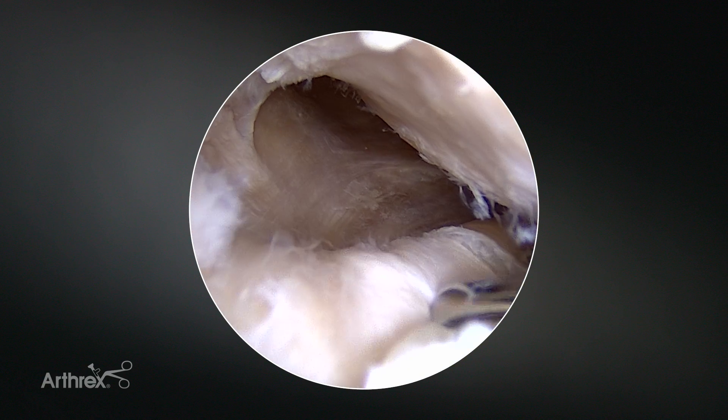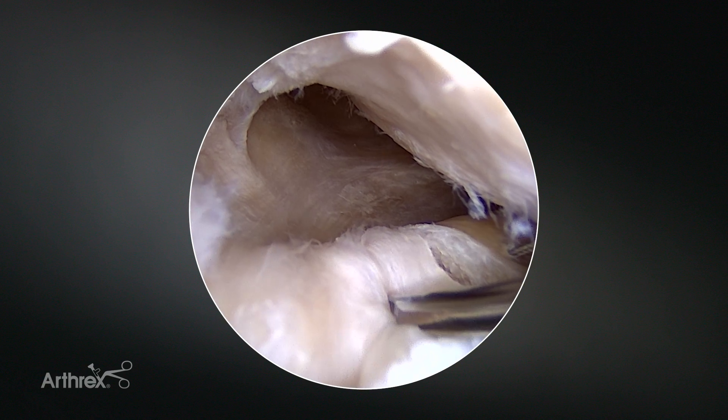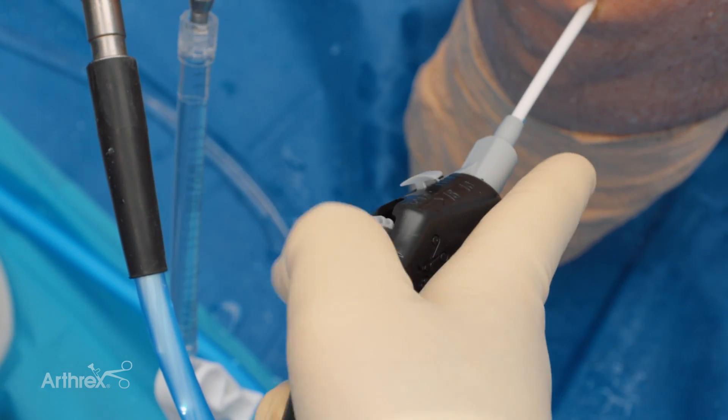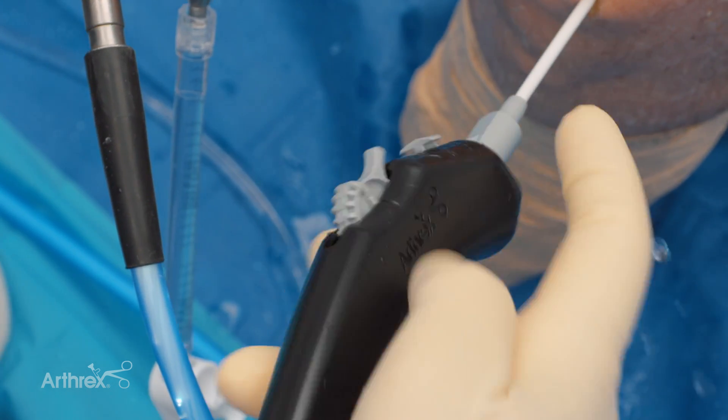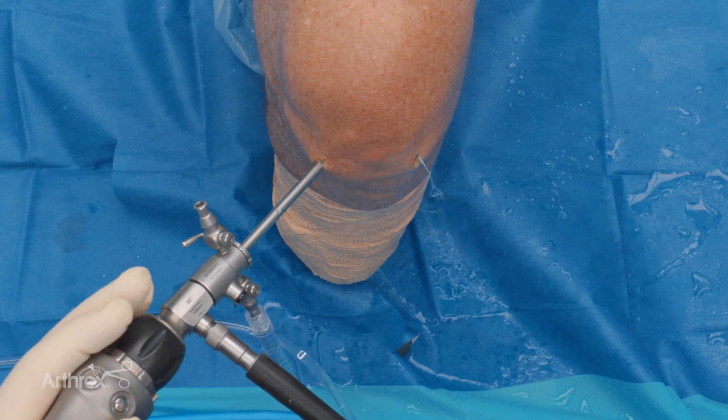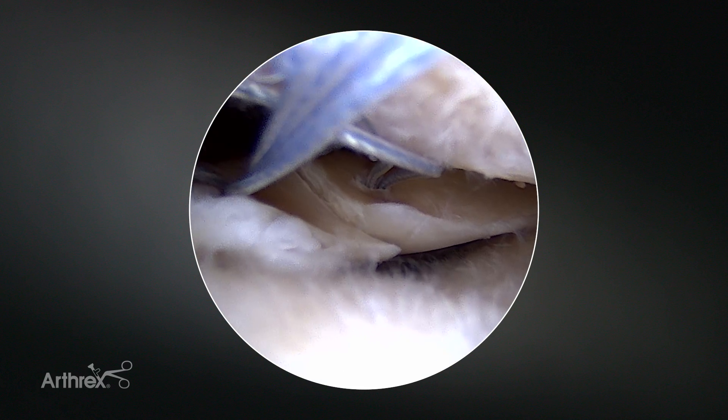Same thing — we're going to want to reduce this side to side. Same technique, second time around. Pull it back towards me, push it forward, and disengage. And so that's what your picture should look like.